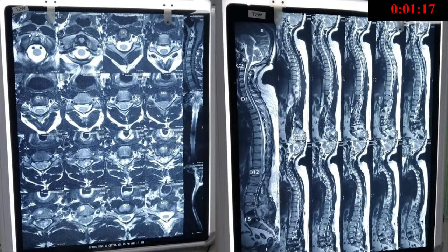So, this is from a very dear friend of mine. We discussed this in Raipur also. 25-year-old, non-diabetic, non-hypertensive, non-dyslipidemic, undergoes a 2-level fusion by biportal endoscopy, L4, L5, L5S1. Wakes up, complete loss of sensory motor function below D10.